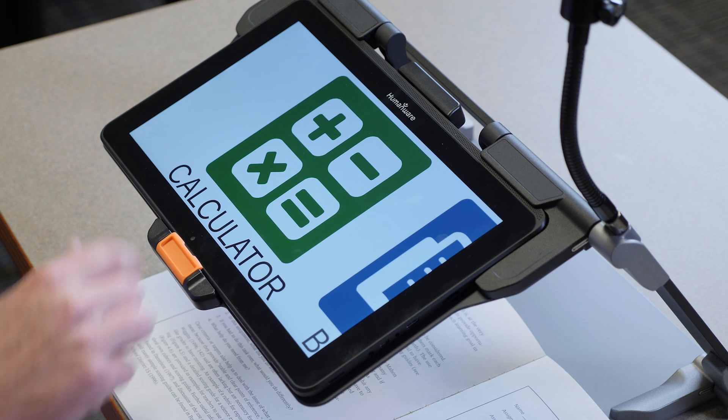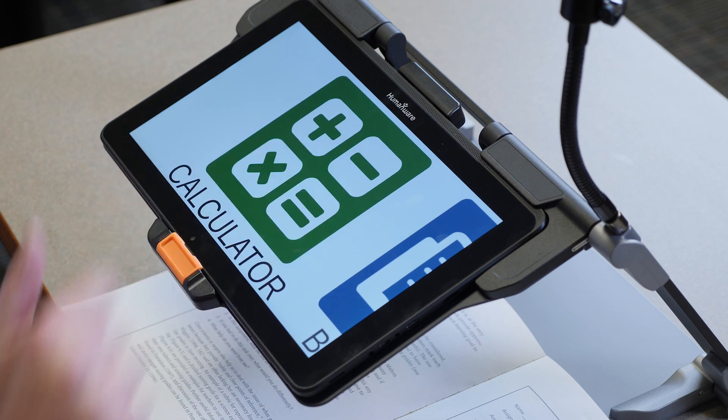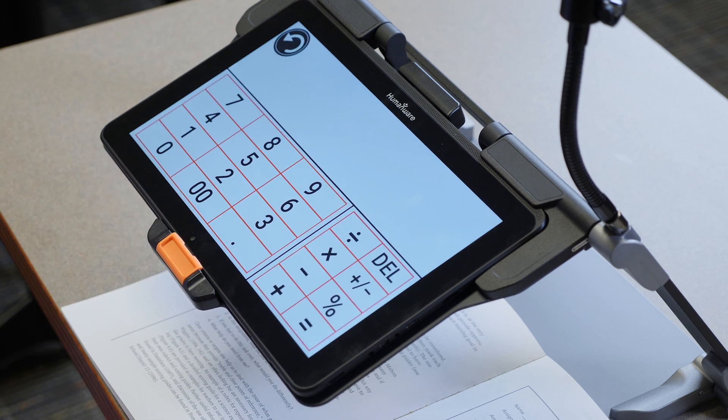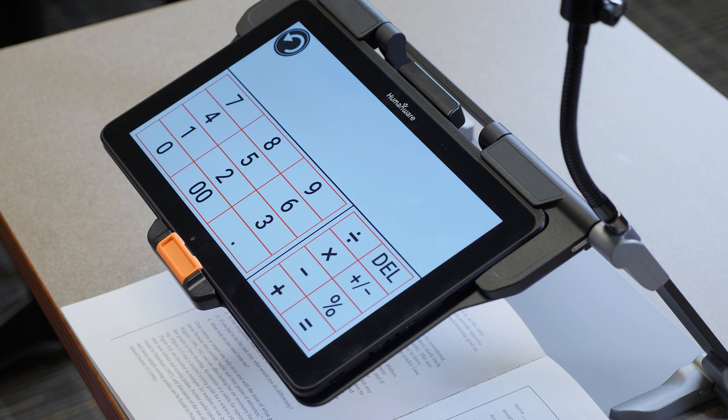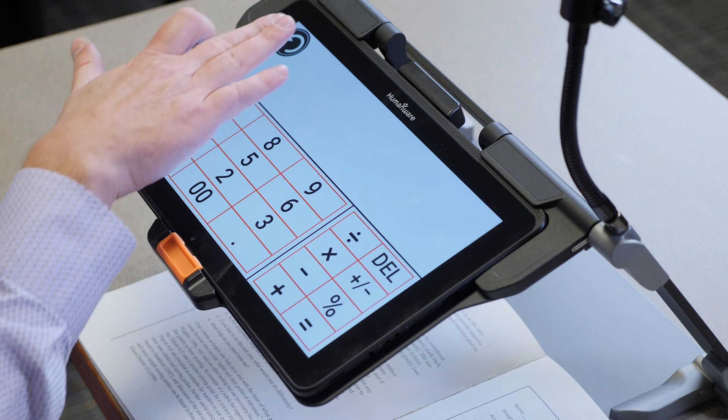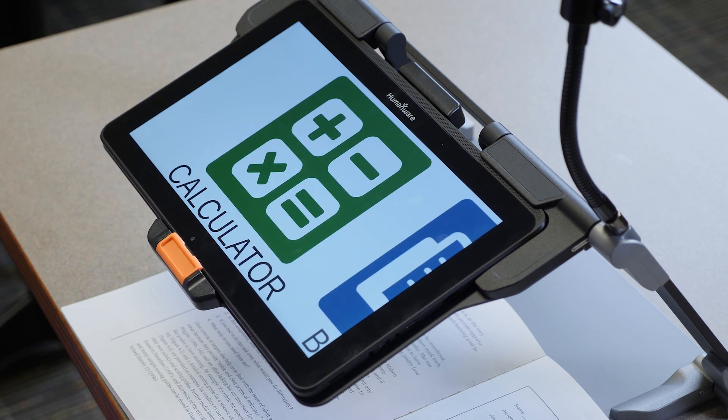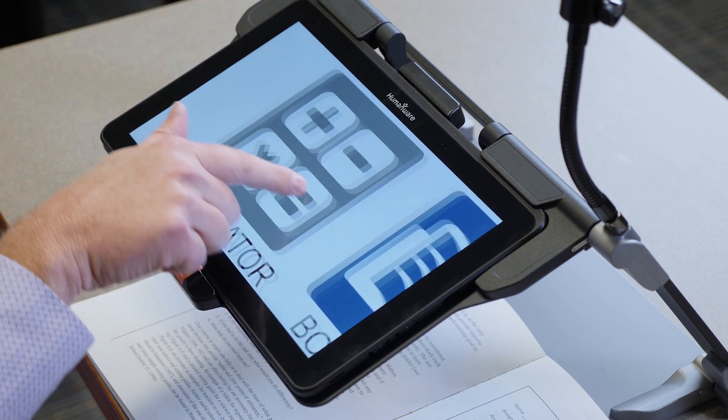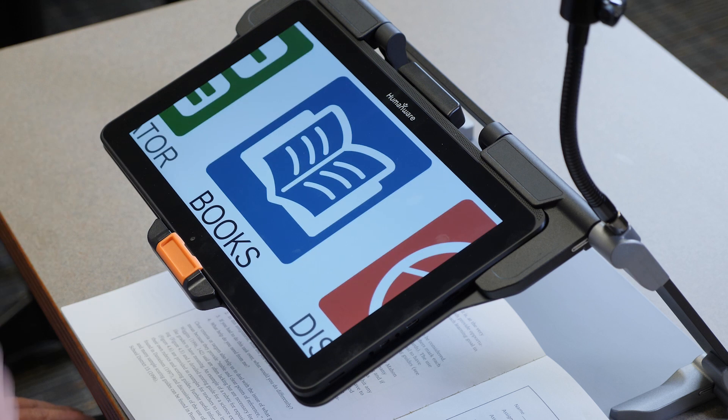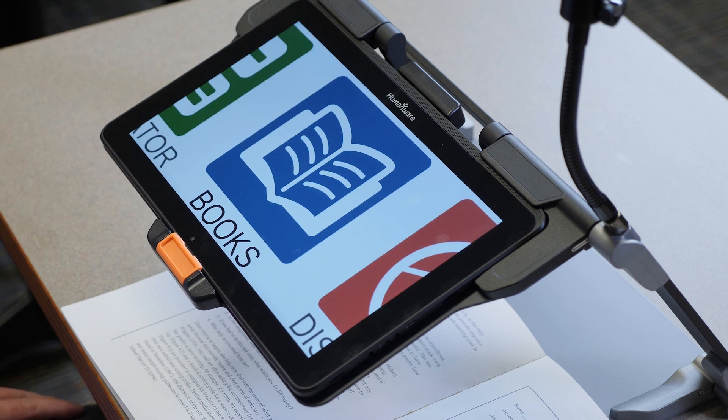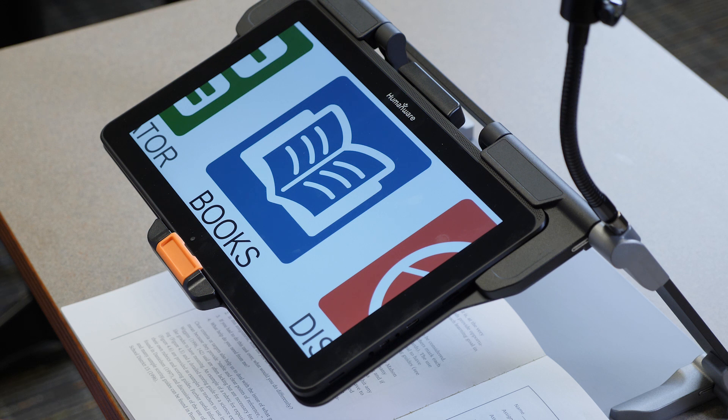So we start off with a calculator. When we click on the calculator, that gives you a full calculator for your students. We can hit the go back button, we can move our finger to the left, and we can go to our next selection within that carousel.